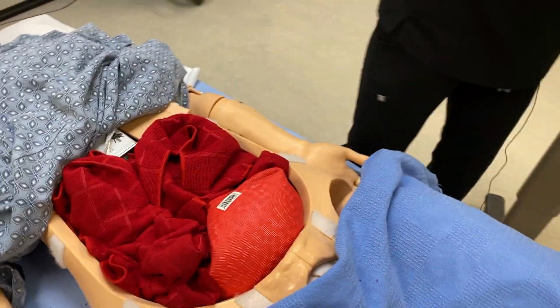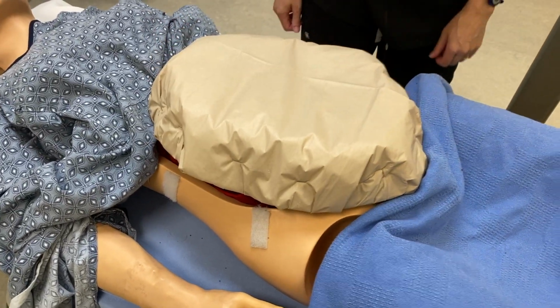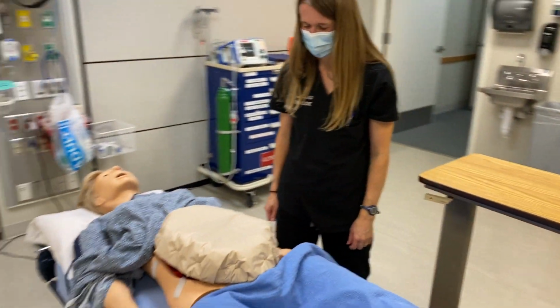And then our belly. And that's it. Okay, we're all done. We're ready to do it now. Ready to cut.